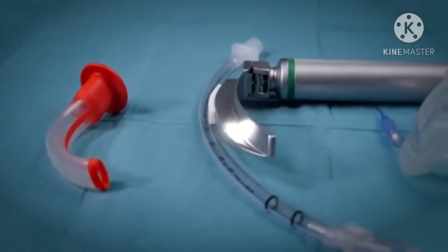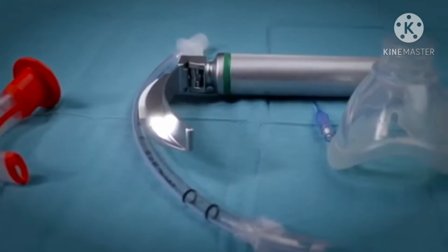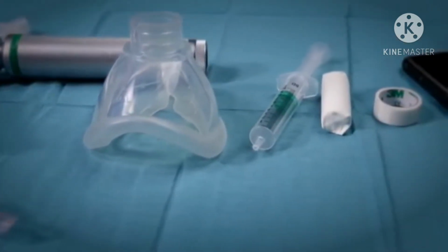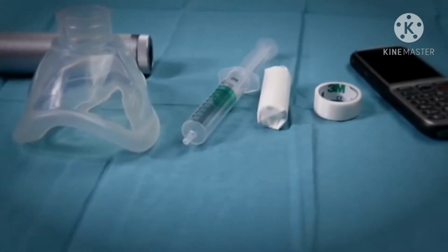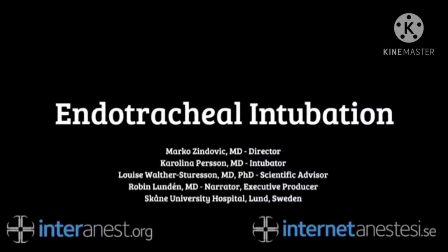Endotracheal intubation is an important part of airway management. It is best learnt through practice under experts. This lesson aims to prepare you for these practice sessions, and our narrow focus is teaching the manual skills that will increase your chances of success.